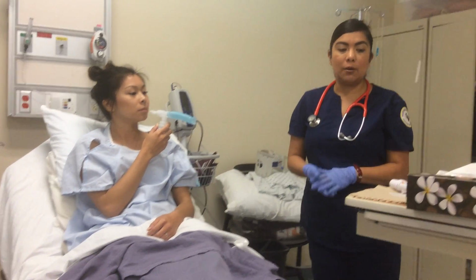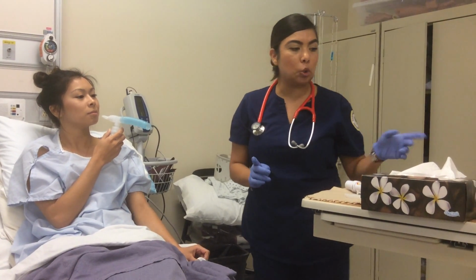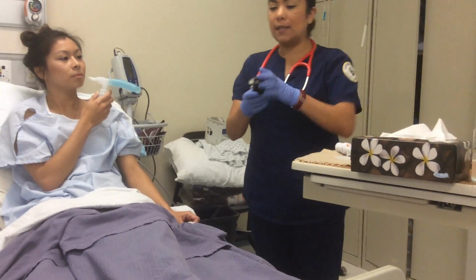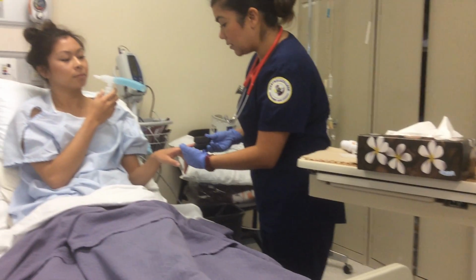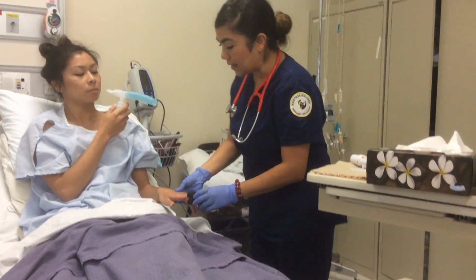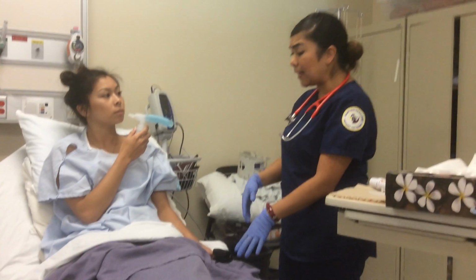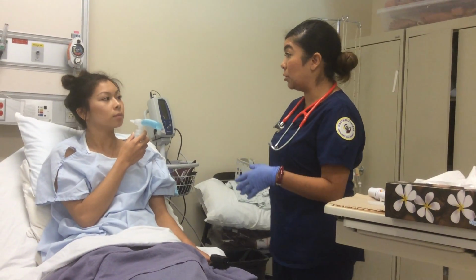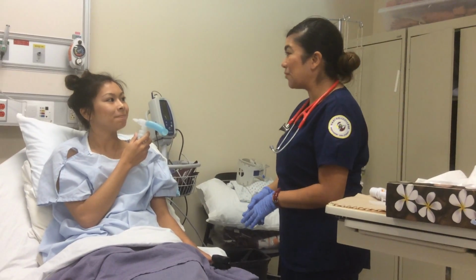And so I will just go ahead and document my vitals and everything. And then I'm also going to place the pulse oximetry on your finger, okay? And just relax. I'm going to leave this here because I just want to make sure that there's no increase in heart rate, or anything. Because if there is, then I would need to stop the medication, okay?